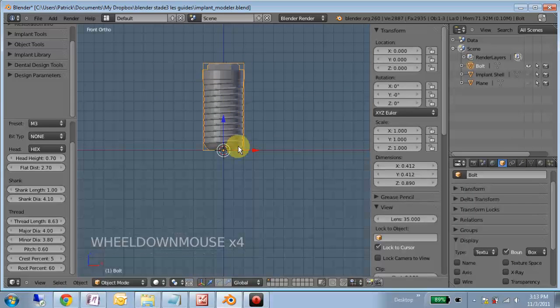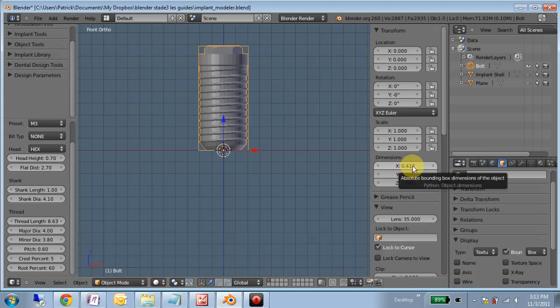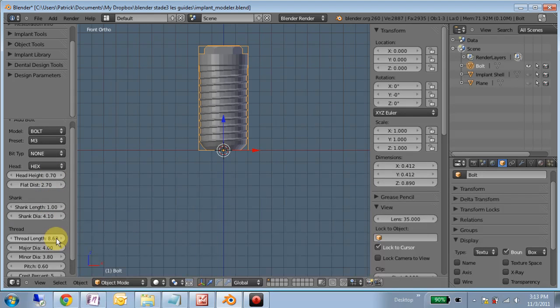look at the total size of this implant. Notice that we've said 4.1 and it's 0.41. And we also notice that the 0.7 plus 1 plus 8.63, well, right here this should be 9.63, and we're not even up to 9 for our total length in Z. So something about the construction of the threads here results in a shorter than expected overall length. And I think it's related to the pitch. It might only do integer loops of the pitch. So my plan is to use this to generate a correctly pitched and threaded segment, cut out that segment, and reattach it to our collar and hex.